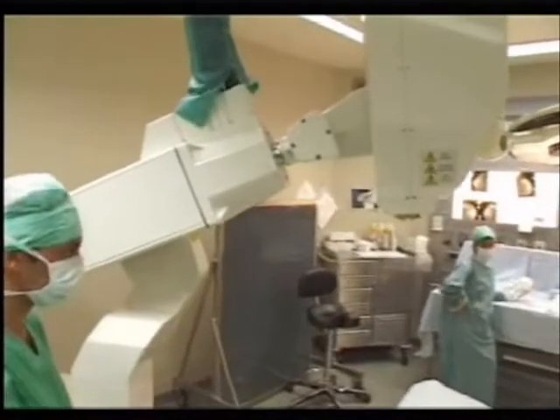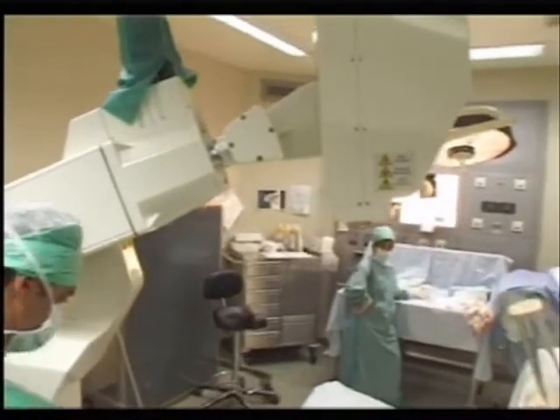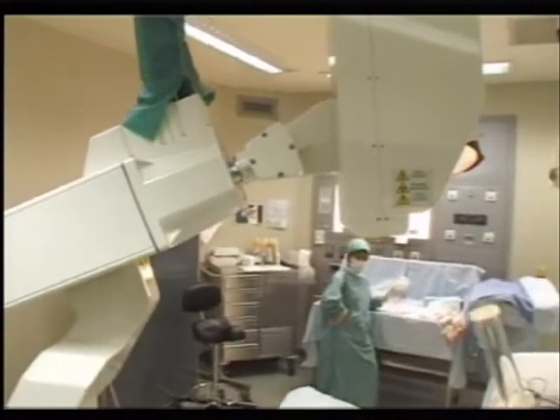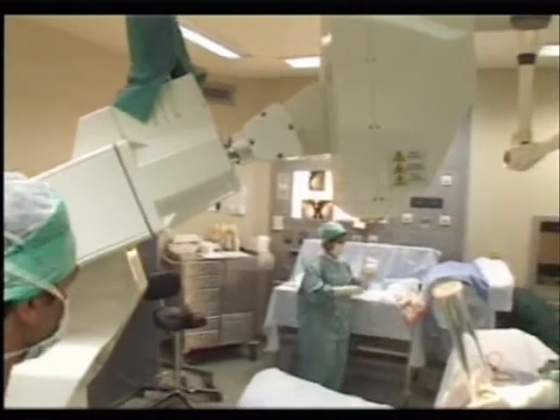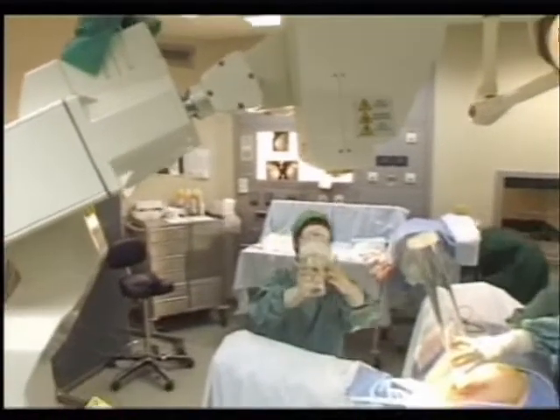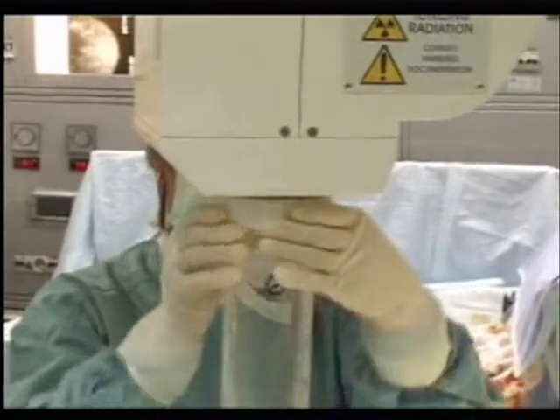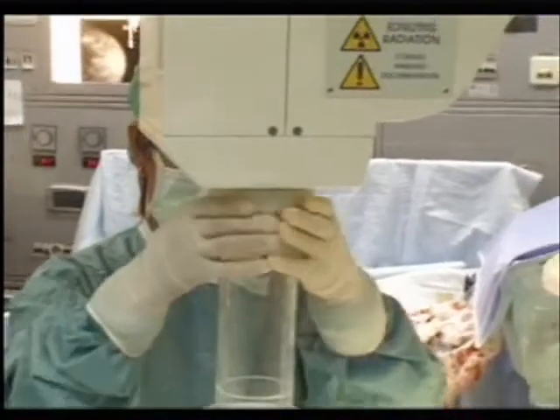The problem of organizing the transport of the patient from the operating room to the radiotherapy unit, which has for a long time prevented the development of this technique and its use on a large scale, has recently been overcome by the availability on the market of small mobile accelerators, which can deliver a variable range of electron energy with a maximum limit of 10 MeV. These accelerators can be installed directly in the operating room.